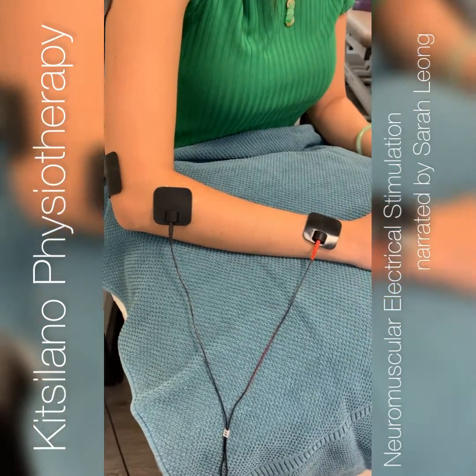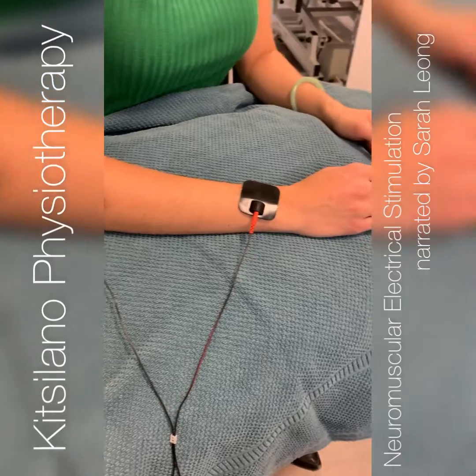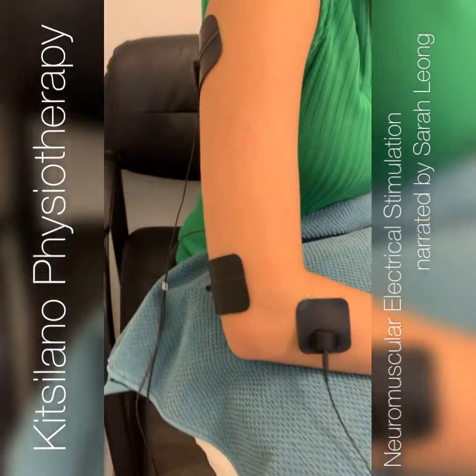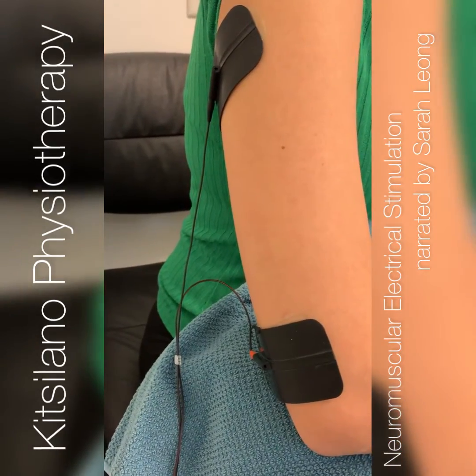What I'm going to show you is the setup for wrist extension, as well as the setup for tricep activation or elbow extension.